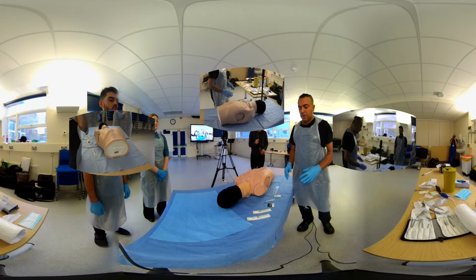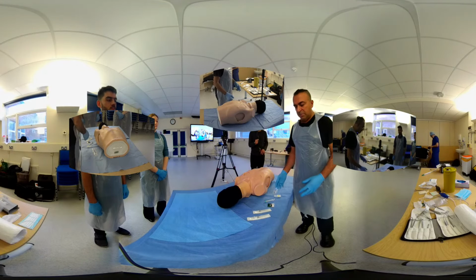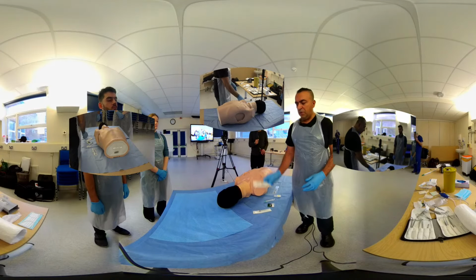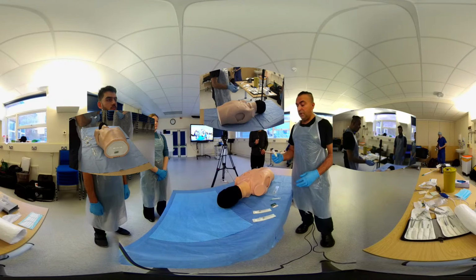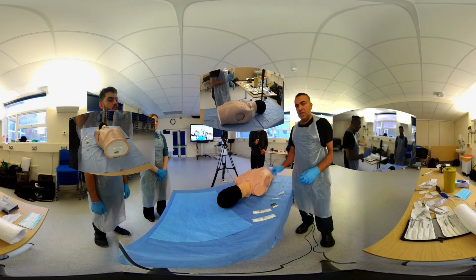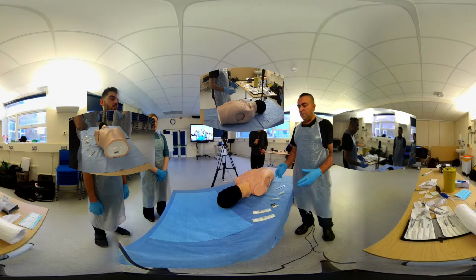So you need to make sure that you have in your brain that tension pneumothorax is the diagnosis. You need to get your kit, and the kit's pretty simple. It's a big grey Venflon, something to clean the area, and a syringe. You may need some local, or the patient may be collapsed, in which case you don't need any local. You don't need a scalpel for this particular procedure. And while you're doing this, you also need to make sure that you've got some observations on if you can.